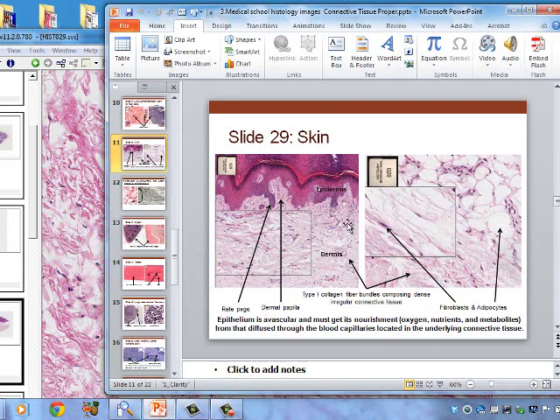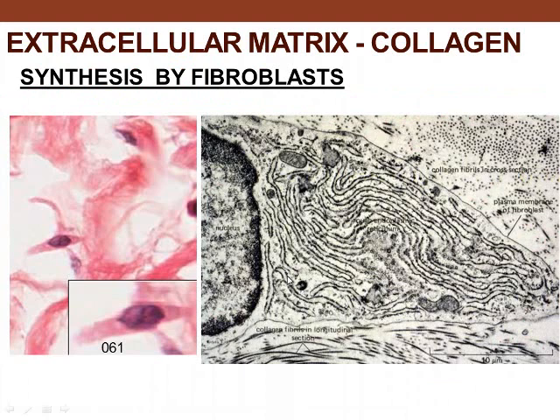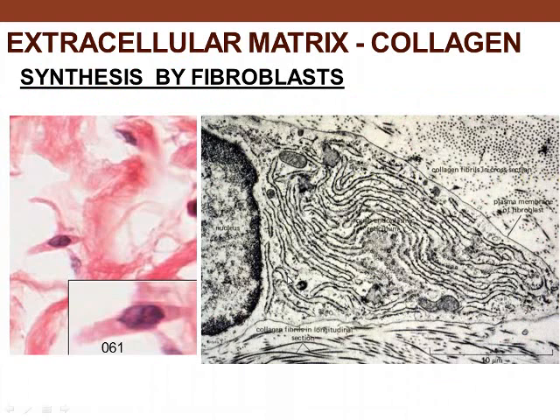Looking at the extracellular matrix at higher power, we see a fibroblast with a euchromatic nucleus that is actively producing collagen — evident from the abundant rough endoplasmic reticulum. The collagen bundles produced by these fibroblast cells are visible as clusters of bundles in the extracellular matrix.